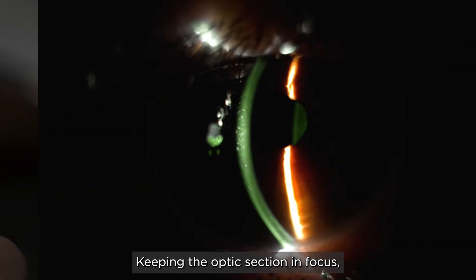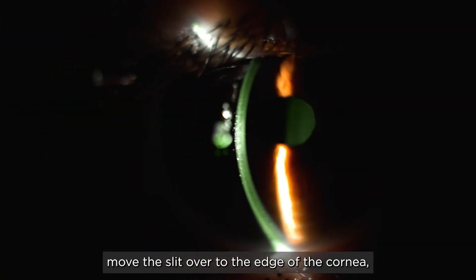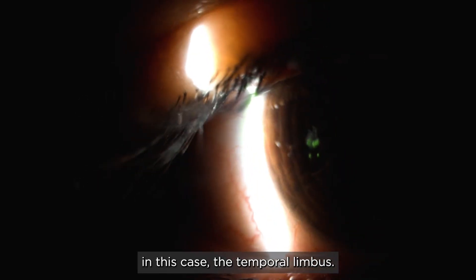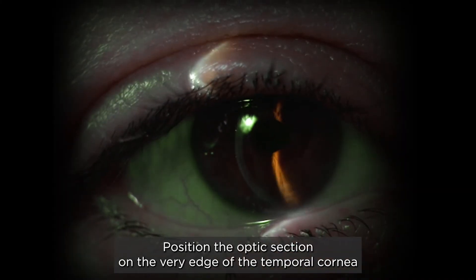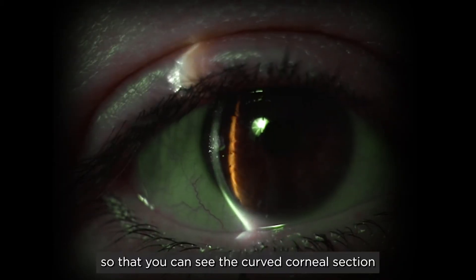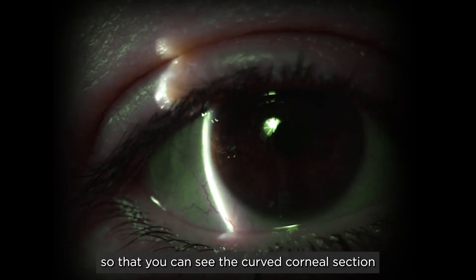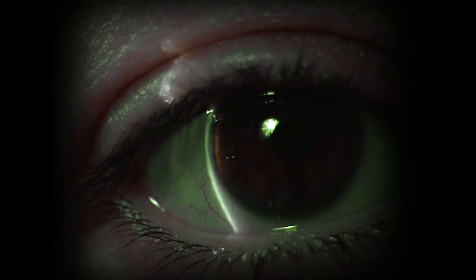Keeping the optic section in focus, move the slit over to the edge of the cornea, in this case the temporal limbus. Position the optic section on the very edge of the temporal cornea so that you can see the curved corneal section and a second section related to the iris.